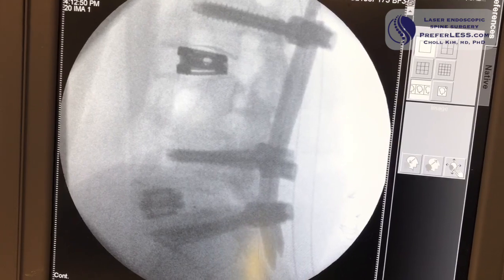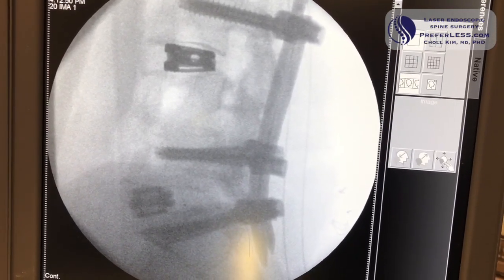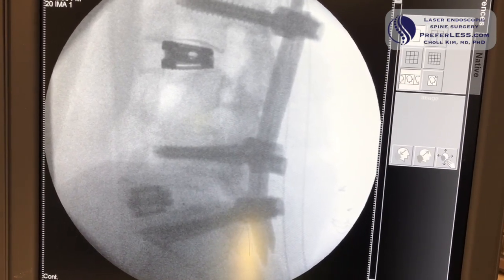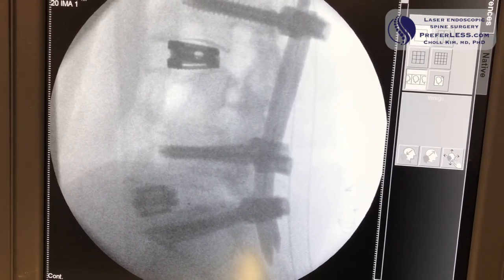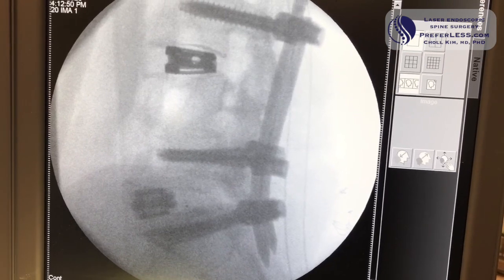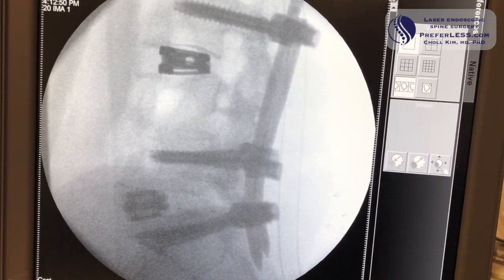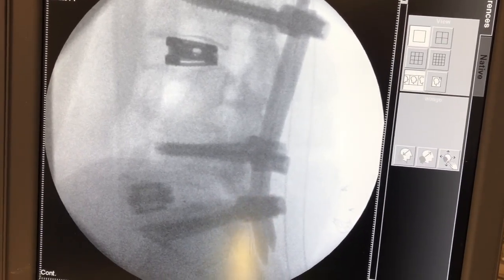The surgery went beautifully. I was able to use all the same screw tracks, so I didn't have to go to the pelvis. And I skirted along the side right next to the broken screws at S1. The L5 screw holes were really rock solid, and then I put in perfect screws into L3. And I think you're going to feel a lot better, feel a lot taller, and be able to stand upright a lot better. So best wishes on a speedy and robust recovery. We're all rooting for you.